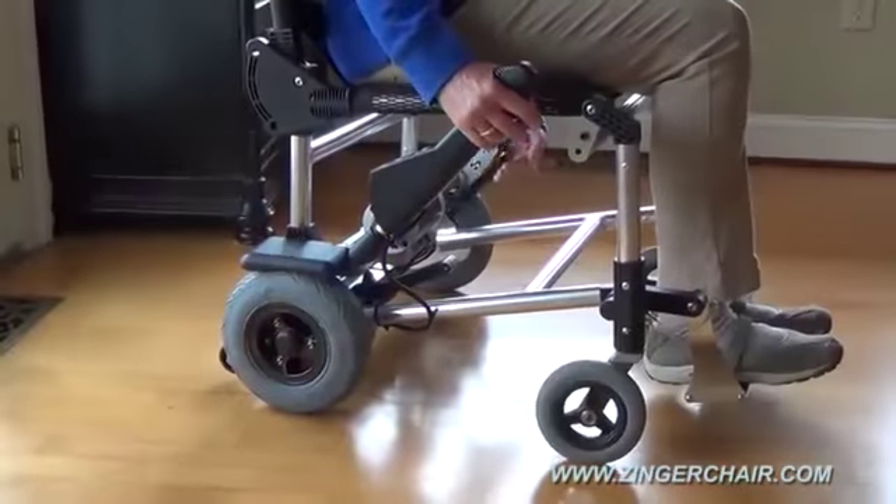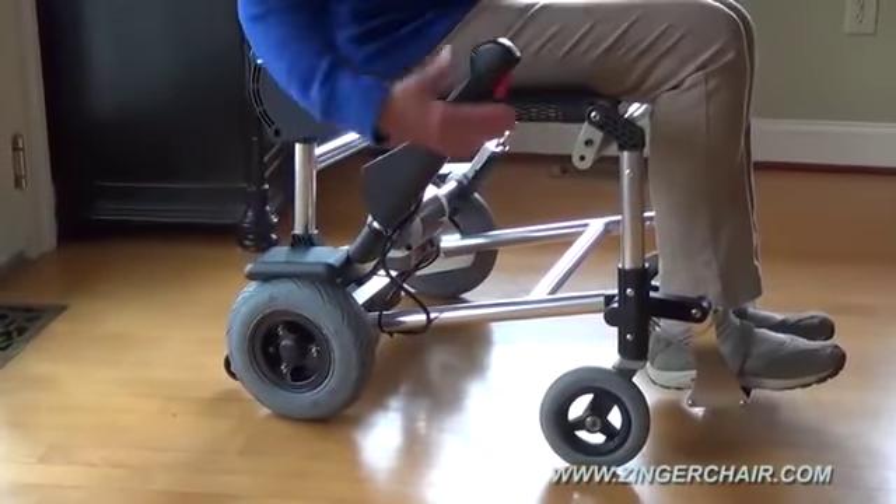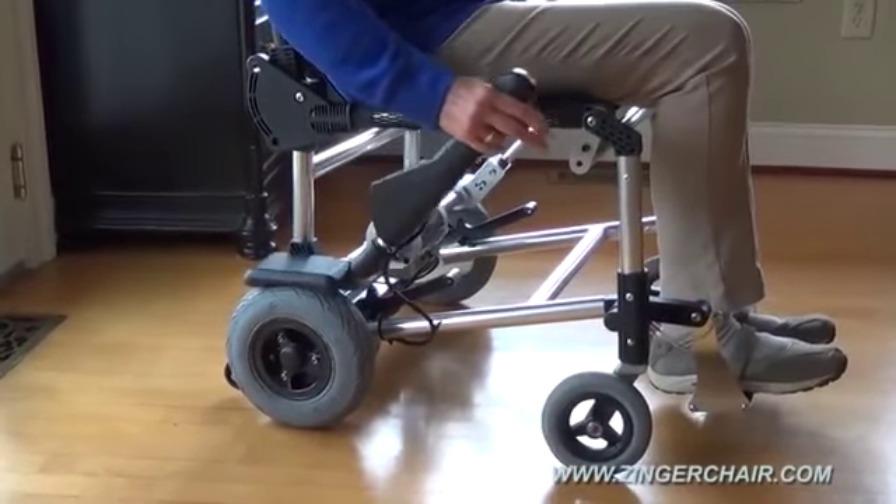To keep the Zinger put, left and right parking brakes are easy to apply and automatically released simply by pulling up on the control handles.